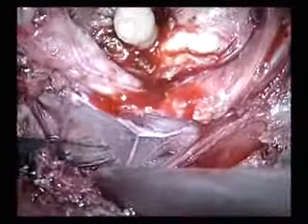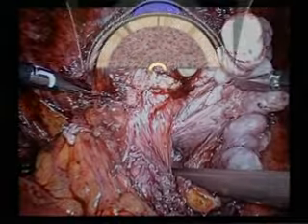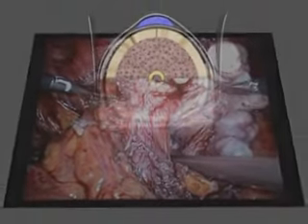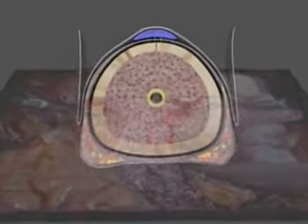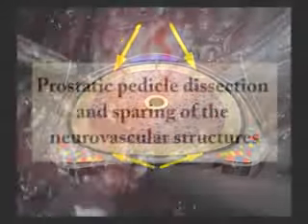At this point of the procedure, the shining surface of the prostatic capsule is clearly seen medially and laterally. As shown in the diagram, during the initial fascial incision ventrolaterally, as well as during the blunt dissection of Denonvilliers' fascia, two planes are created to guide intrafascial nerve sparing.